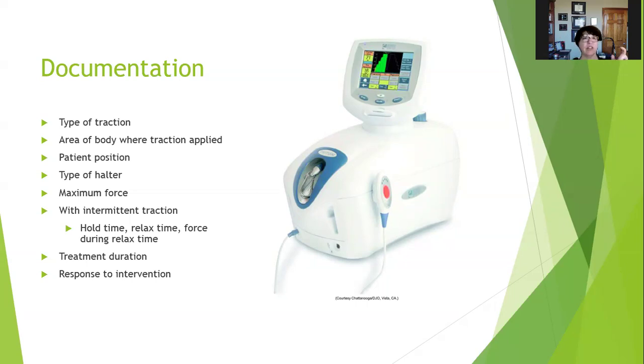So sometimes it's, let's just say 75 pounds. I'm just going to say that for a person that weighs 150 pounds. So you'd say 75/0, 15/15. So if you're not going all the way to 0, so 75/10, 15/15. So you let off some of the pressure, but not all of it. You could do that. How long you did it and how the patient responded. Makes sense, right?